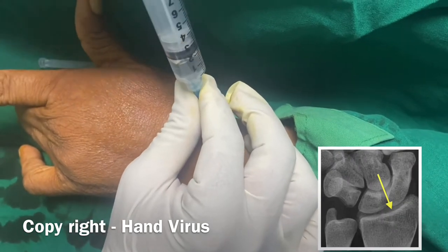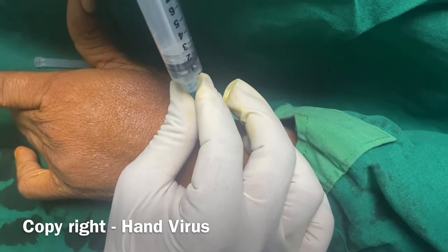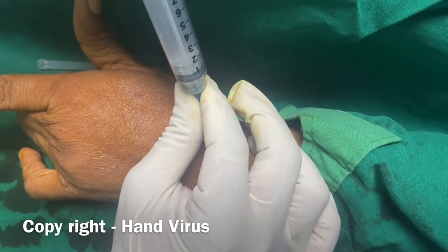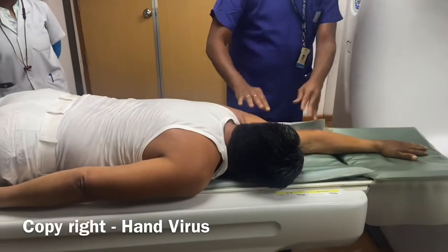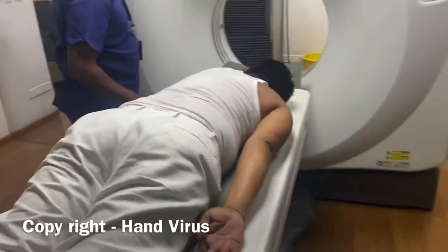I am going to give 2 cc to the radiocarpal joint. This injection is finished. The patient is now in the superman position for the CT scan.